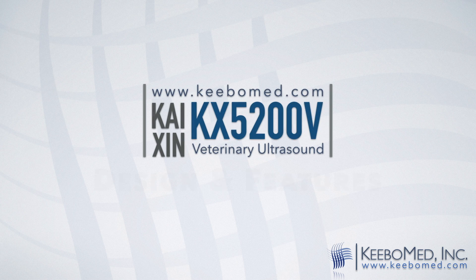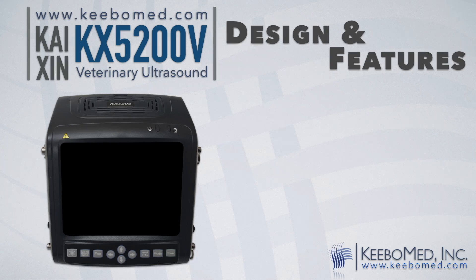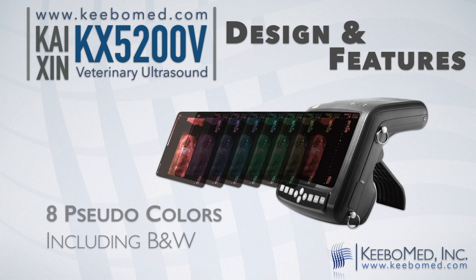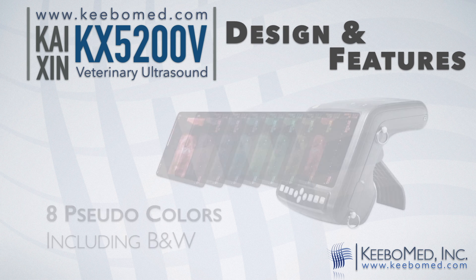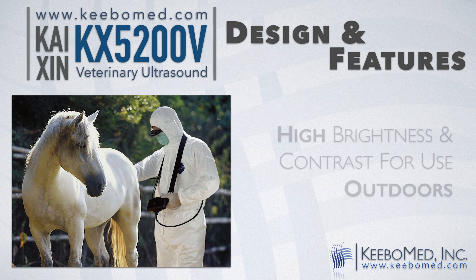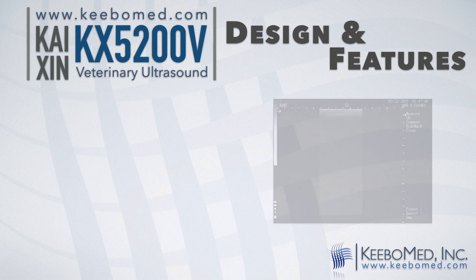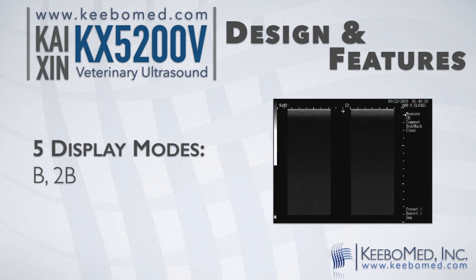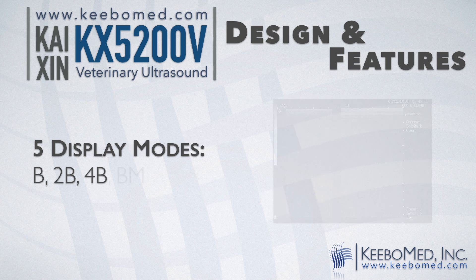The design of the KX5200V allows for easy use and its many features provide much adaptability. The 5.7-inch high-resolution color LCD produces high-quality images. It features eight pseudo colors including black and white. The high brightness and contrast adjustments allow for outdoor use. It has five display modes: B, 2B, 4B, V, and M.